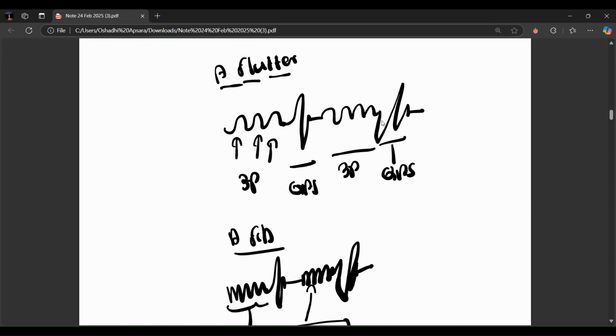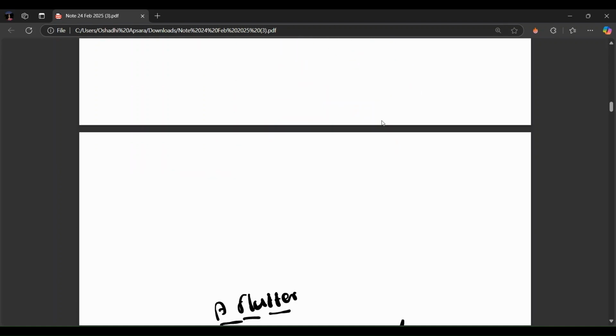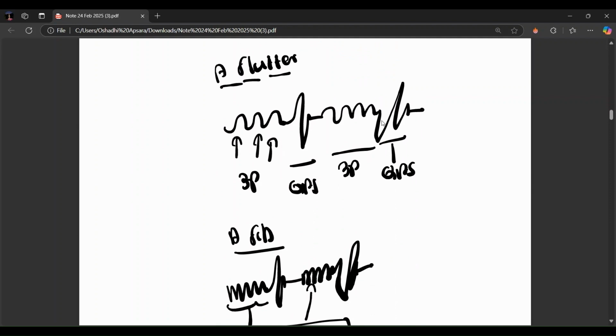Next, the P wave. There are some other situations where sometimes you can't find and underline a P wave in the ECG in the second lead. So if you can't underline the P wave in the second standard lead, just take the V1 lead. There could be a positive or negative P wave. And when you talk about the P wave, what does it indicate?